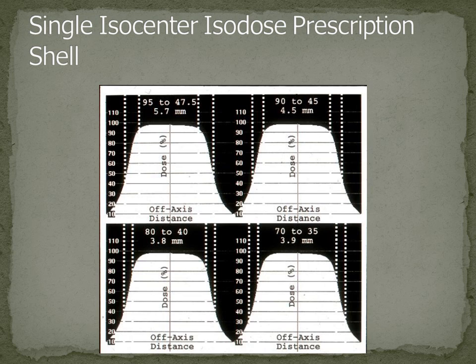That's very important. It turns out in some of the other techniques, while you can do that, it's a lot easier to not optimize. So we've stayed with sphere packing over the years because if you practice it properly, and we have some tools that we'll show you today that allow us to do that, you can get this steep dose gradient at that interface every time.